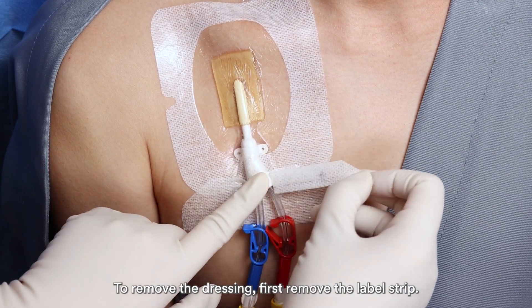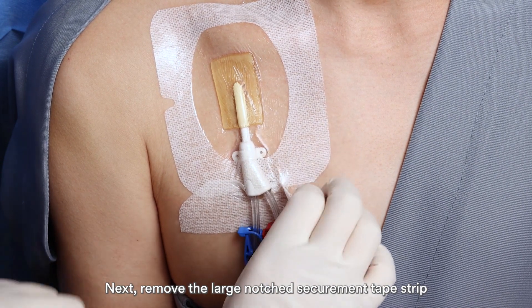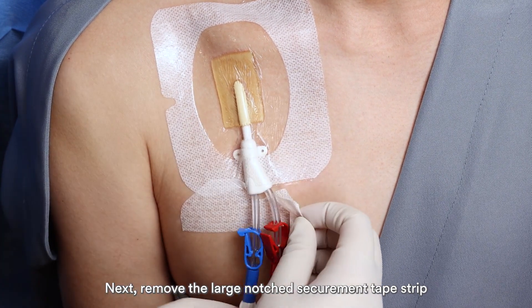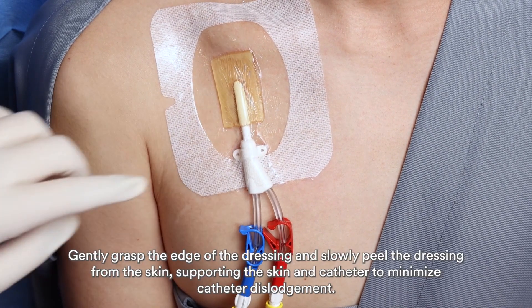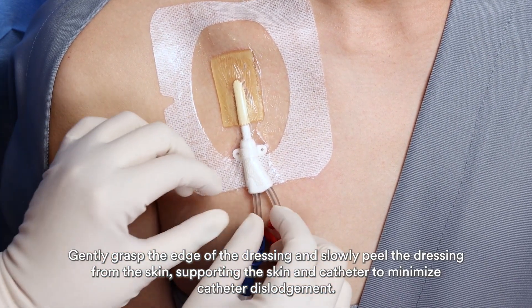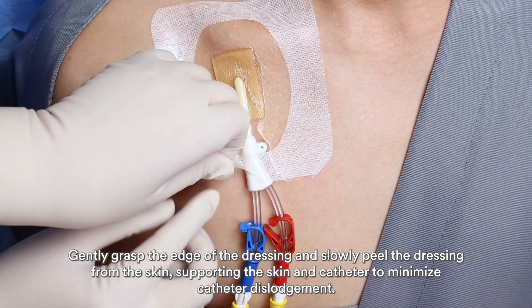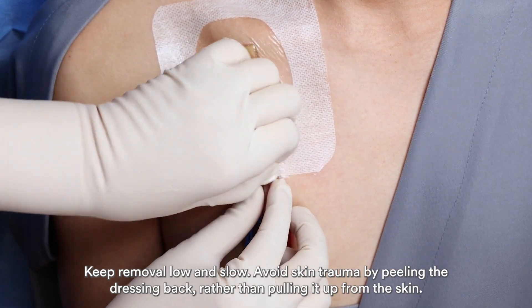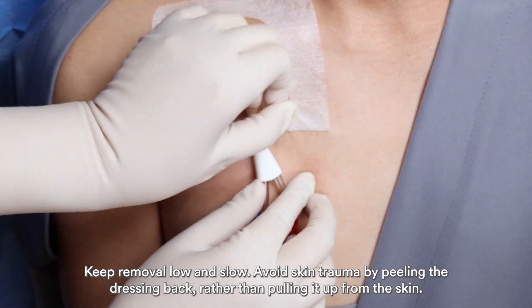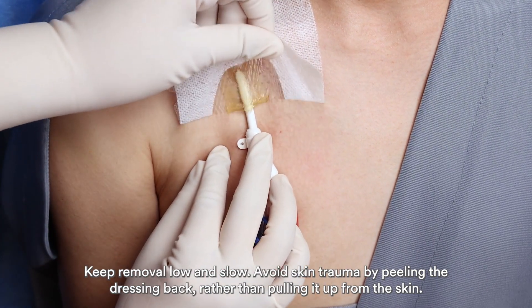To remove the dressing, first remove the label strip. Next, remove the large notch securement tape strip. Gently grasp the edge of the dressing and slowly peel the dressing from the skin, supporting the skin and catheter to minimize catheter dislodgement. Keep removal low and slow. Avoid skin trauma by peeling the dressing back rather than pulling it up from the skin.